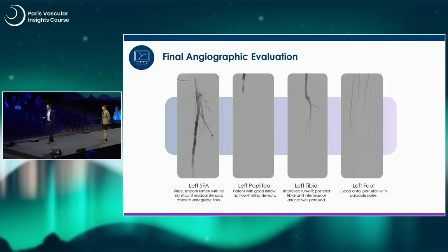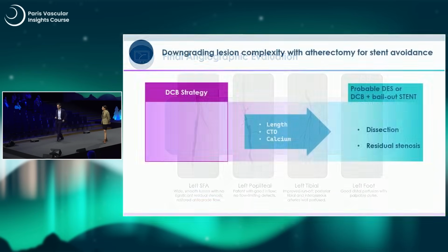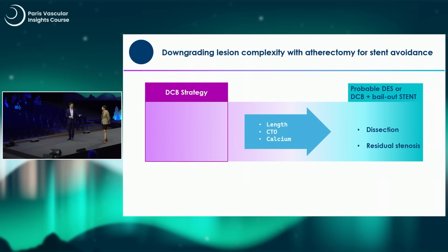So this was our strategy. Of course, I think there are other ways to treat these kinds of patients, but we really wanted to gain lumen, avoid dissection, and avoid stent implantation in this case. Thank you. Good, perfect. Thank you.